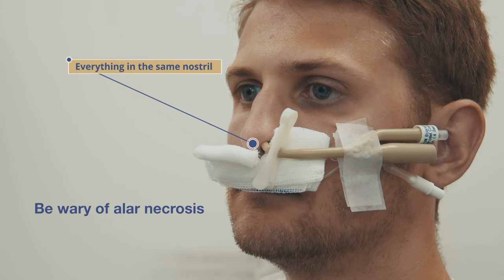It is vital to place gauze in between the clip and the skin of the alar area to prevent alar necrosis.